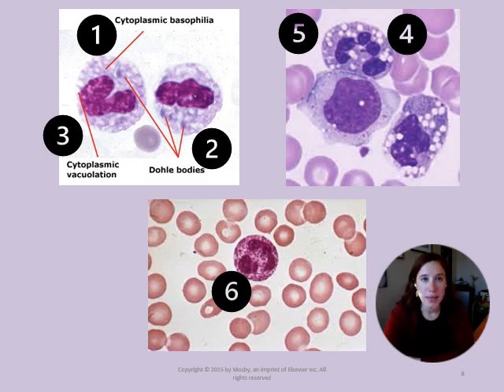Number 4, we can see the neutrophil is darker than the lymphocyte, which is not normal. And then additionally, number 5, we're also going to see those vacuoles. That's a pretty gnarly one. And number 6, it looks like an eosinophil, but it's not. It's actually toxic granulation, since this is a neutrophil. Again, we may be seeing some sort of infection or inflammation causing toxicity within that neutrophil.